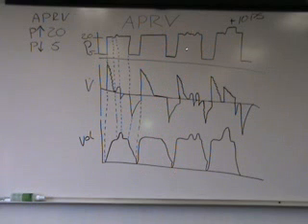This third breath re-illustrates the first point. P high is established. You have a decelerating flow pattern. This person breathes twice spontaneously on top of that P high. They have two sinusoidal flow patterns, giving them volume in, volume out, volume in, volume out on top of the volume that was already delivered. Okay, and then at the end of the P high, it comes down and he exhales.